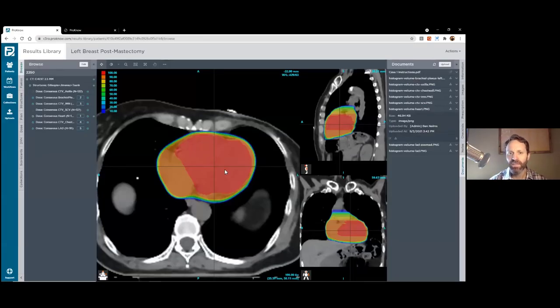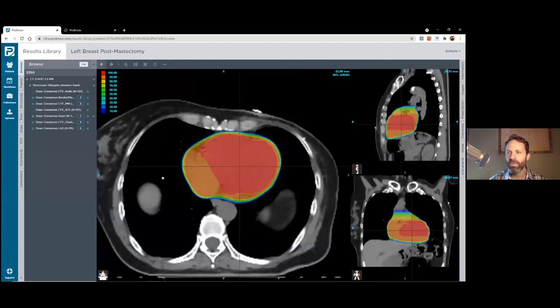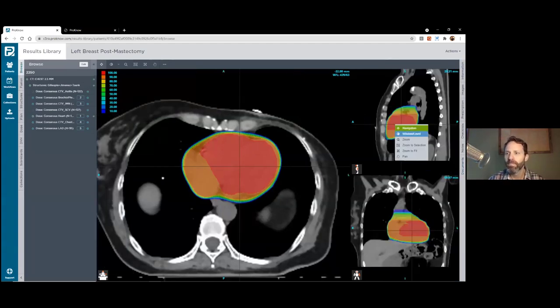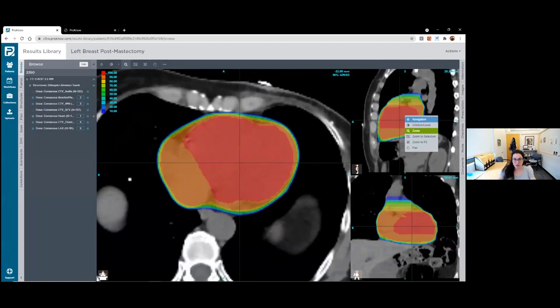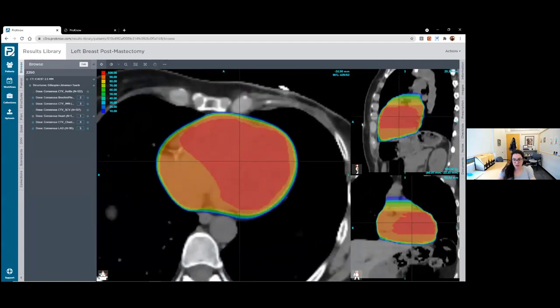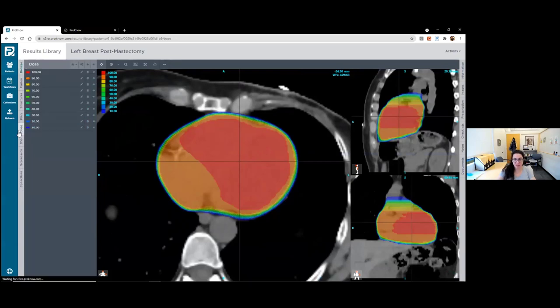Here's the volume of the heart histogram. The minimum contoured was 362 cubic centimeters; the max was 768. I rendered the 25th percentile, median, and 75th percentile on the chart. So what stands out to me is that the inferior portion of the heart — which I would think would be encompassed in most people's contour — is missing in about 10% of people. It looks like the whole inferior portion of the heart is missing, as well as some of the posterior portion.